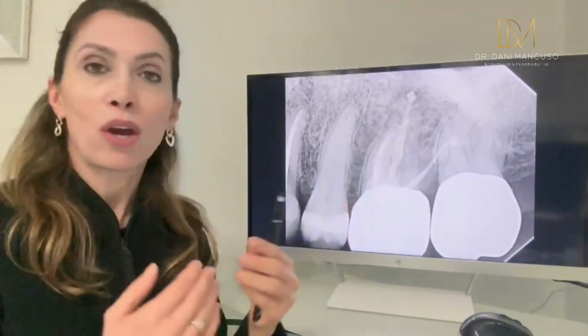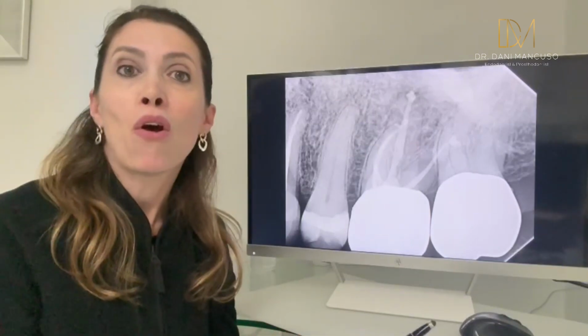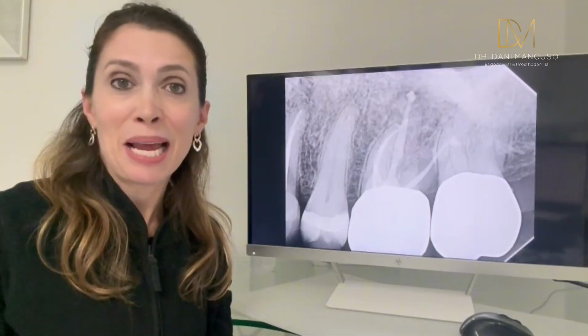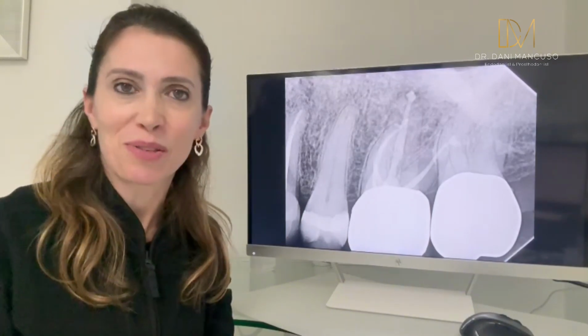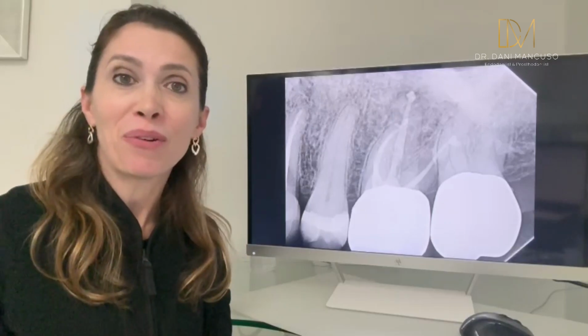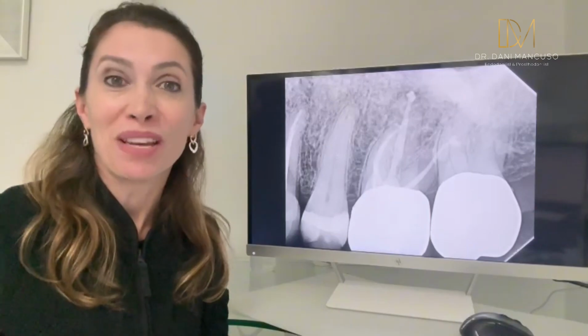So try to do that, because that's when you are going to see your GP matching the correct anatomy of your canal. And this step can dramatically improve your outcome and success rate. And your final x-ray will be more beautiful as well, which is always good to see.